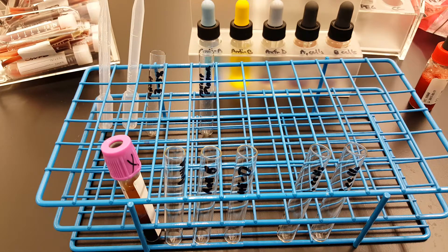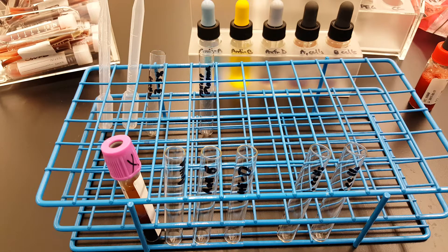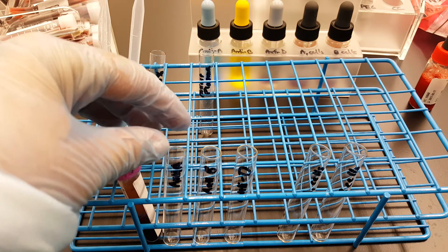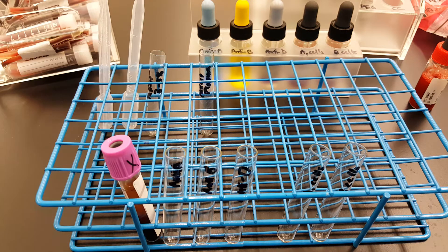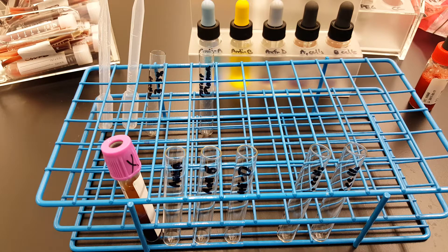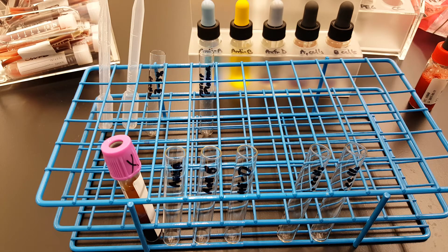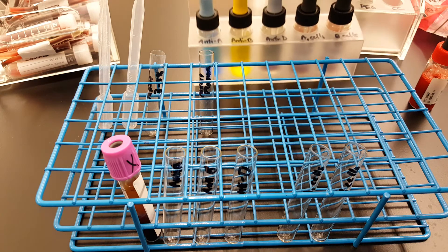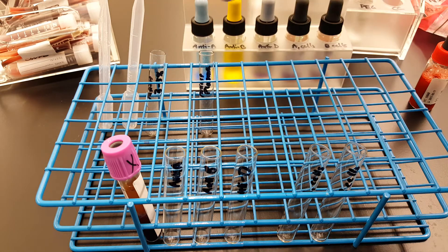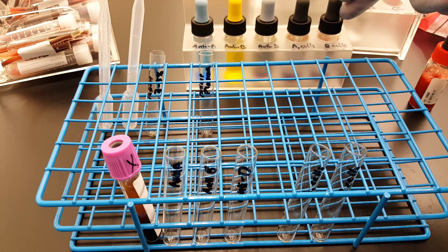The first thing that you're going to do when you do any testing is label your tubes first. So with ABO testing, you're going to have a tube that has the patient's name on it, but also the reagent on it. If you'll notice this rack back here, my tubes are matching the reagents that we're going to use in them.